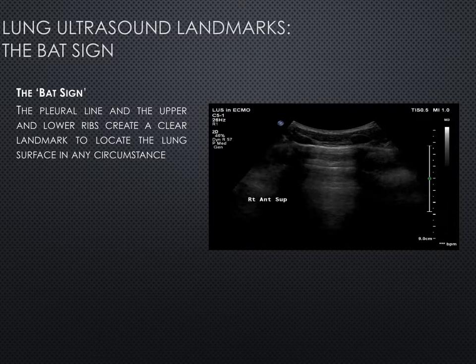Because sometimes what you're trying to identify is that the pleural line's not moving. And if it's not moving, that's where you need your landmark techniques to say that this is where it should be and this is where it is moving.